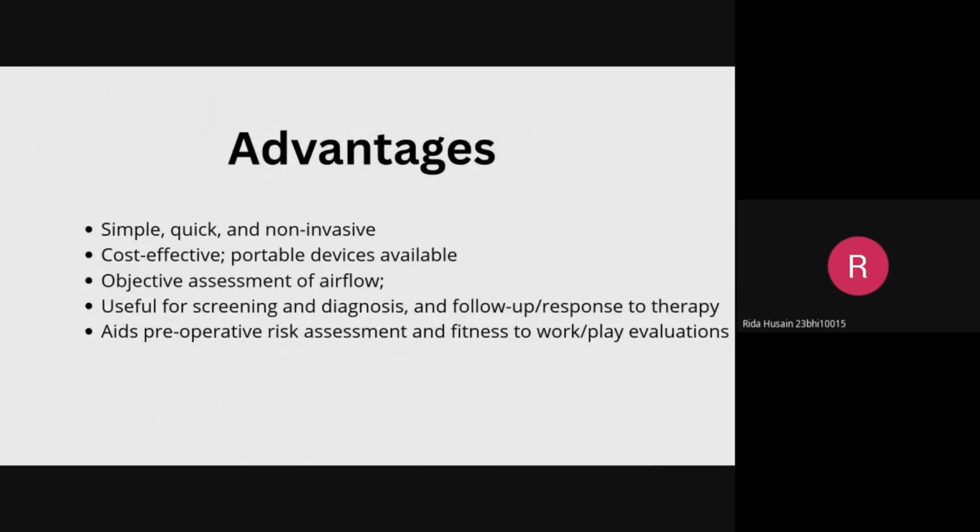Now, some advantages. They are simple, quick, and non invasive. They are cost effective, portable devices, with objective assessment of airflow. They are useful for screening and diagnosis and follow up of response to therapy, aid preoperative risk assessment, and support fitness to work or play evaluations.